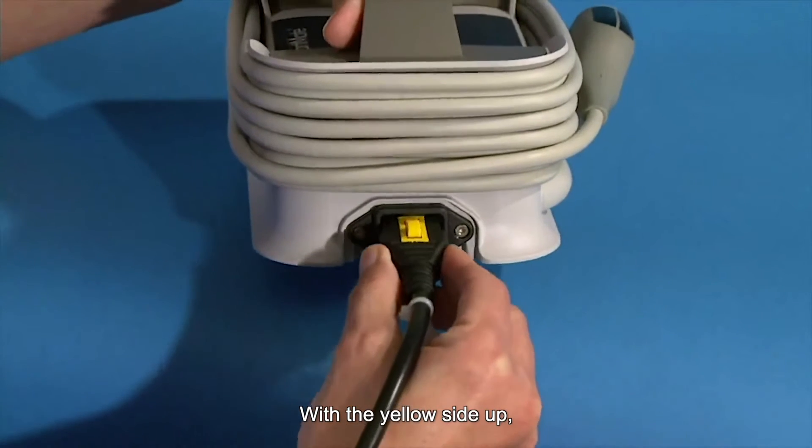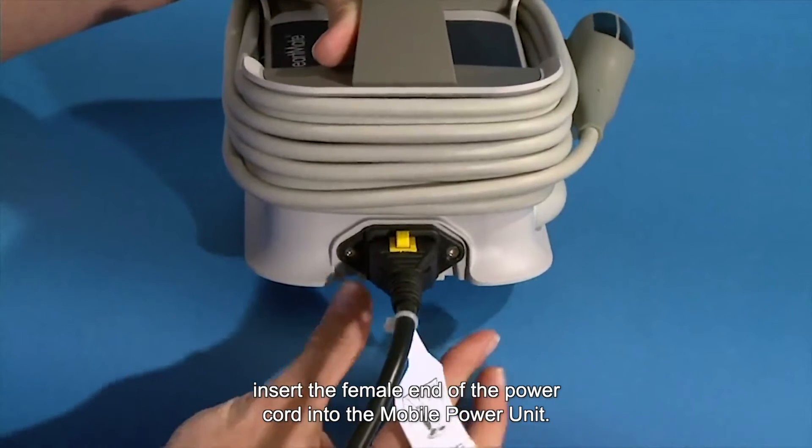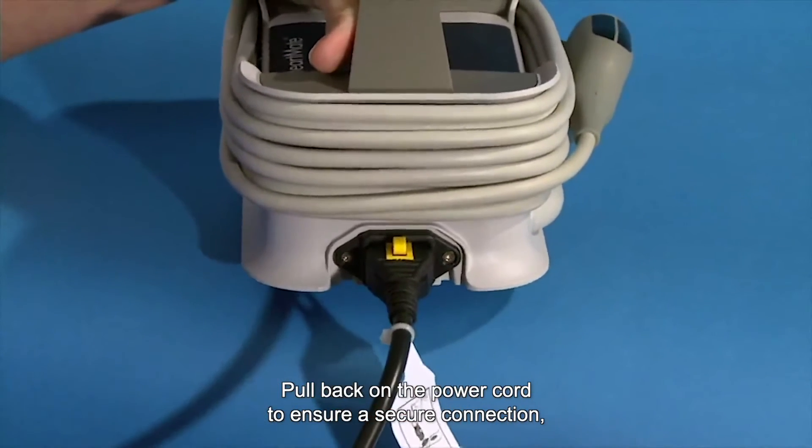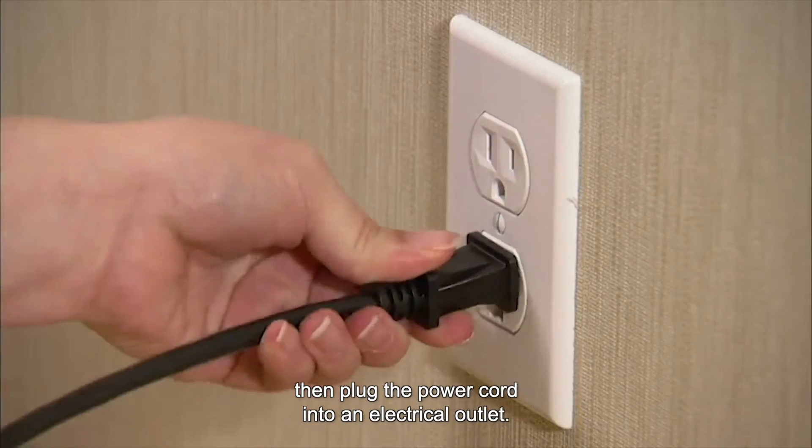With the yellow side up, insert the female end of the power cord into the mobile power unit. Pull back on the power cord to ensure a secure connection. Then plug the power cord into an electrical outlet.